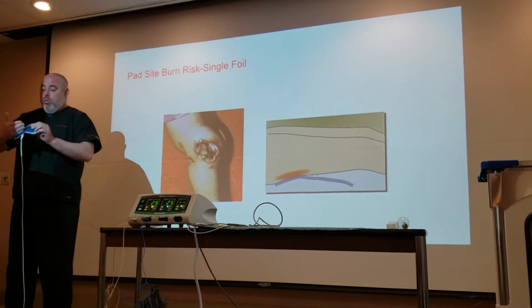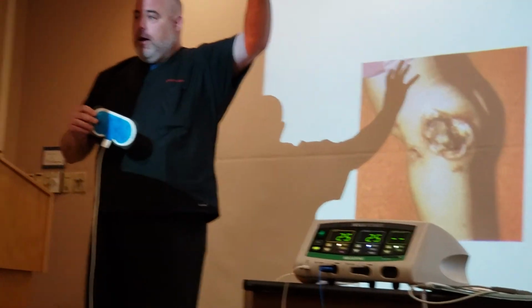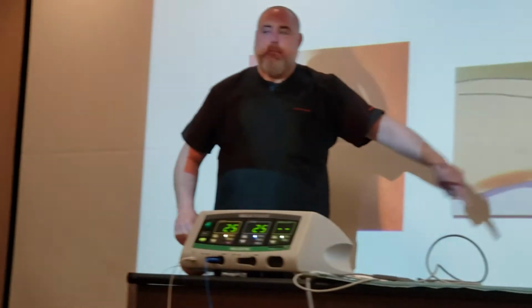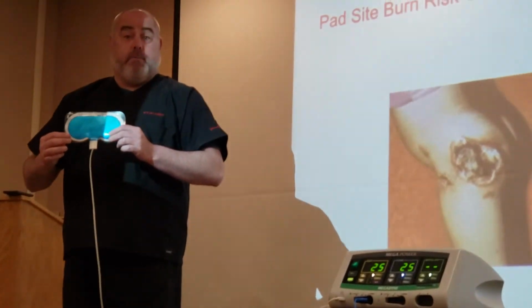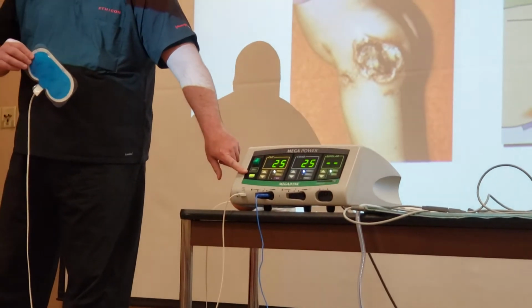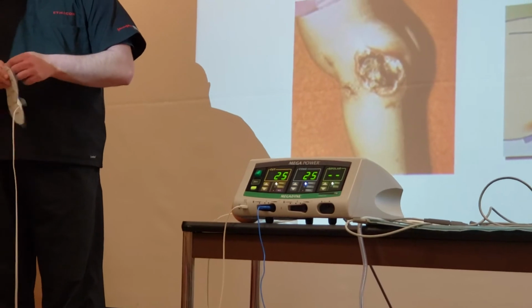So where this is one surface area, again, high current concentration at an active electrode, we want to disperse it over this area. When it starts to peel up, am I getting rid of that surface area? I am. It's a big problem. So when this starts to peel, is this green? Absolutely is, right? Is it attached to anything? So this can be a big problem.